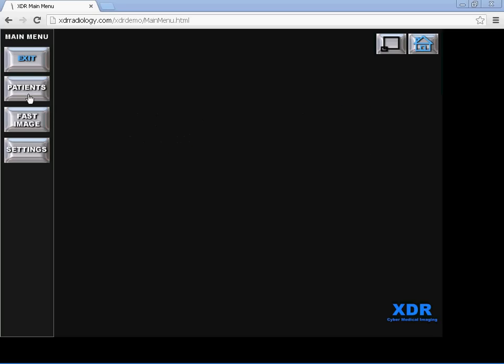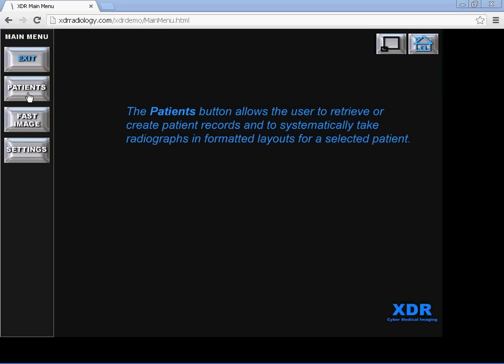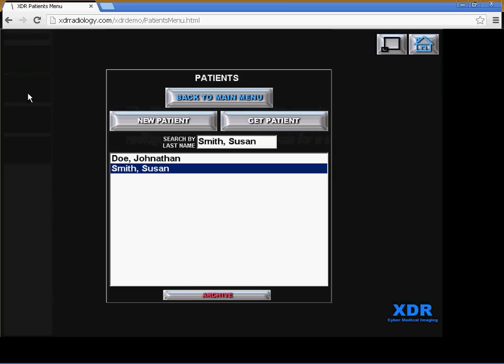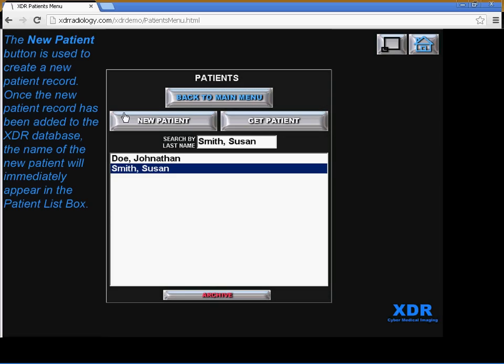Let's click the Patient button for example. You have New Patient and Get Patient. New Patient button is used to create a new patient record. Once that record's been added to the database, the name of the new patient will immediately appear in the patient list box below.